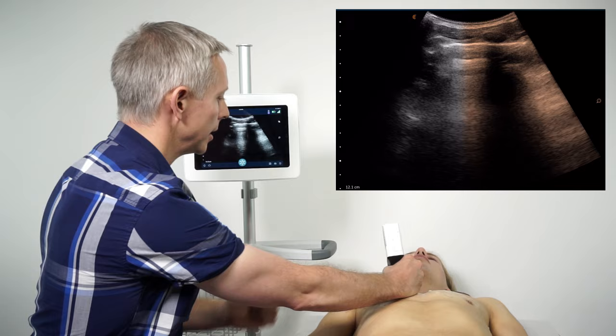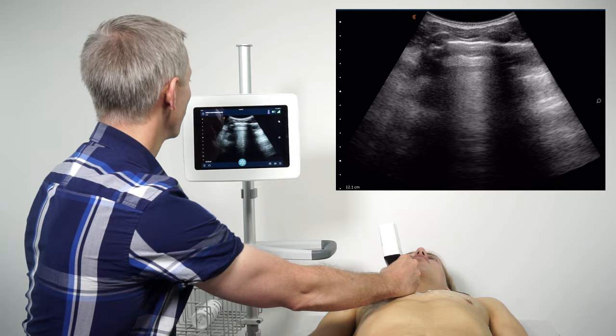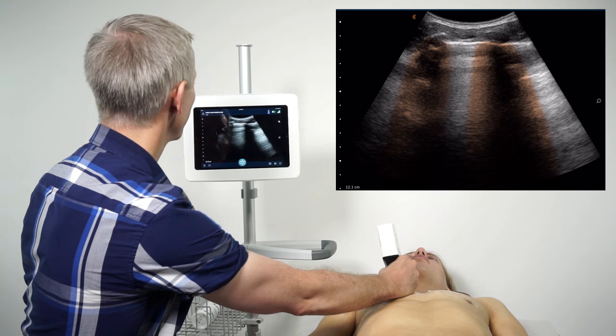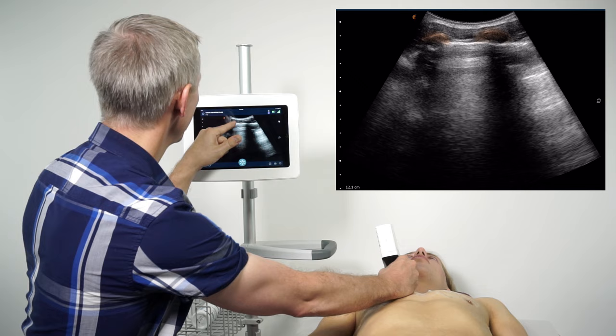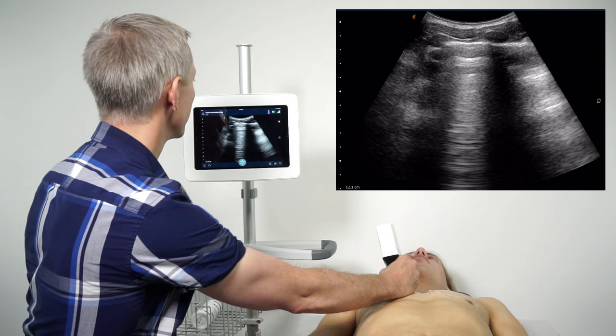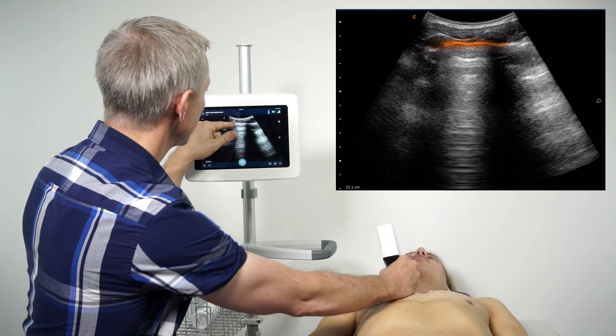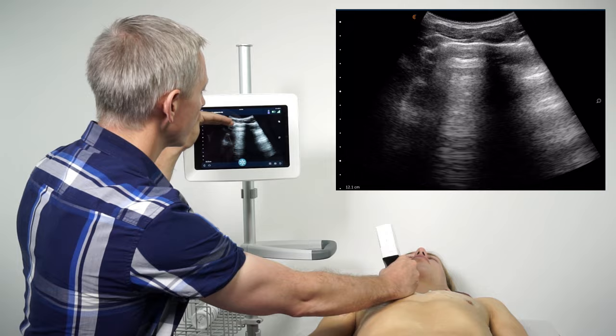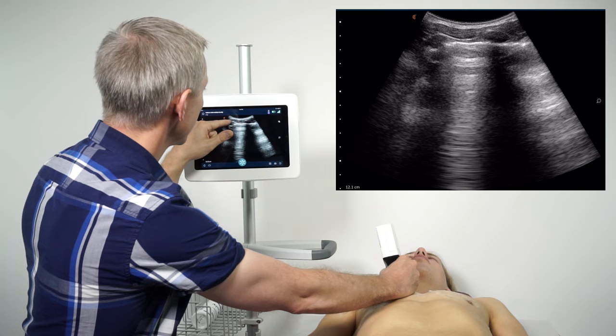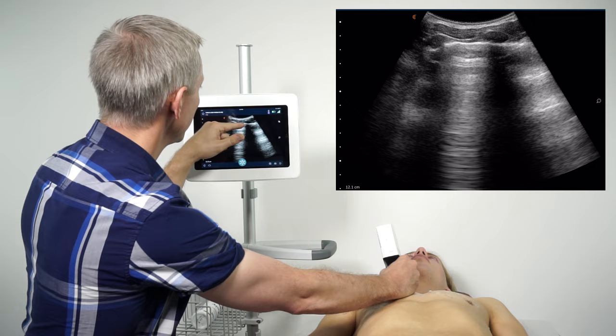The first thing I want to do is identify where the ribs are. I note there are a couple of dark shadows that spread out down across the screen, and as I follow those up superficially I can see the hyperechoic arcs of the anterior surface of the ribs sitting in the soft tissue. Once I've identified that position, I know that the pleural line is just about half a centimeter below that anterior surface of the rib. There are all kinds of horizontal lines on the screen, and using the rib landmarks I can identify which one is the pleural line.